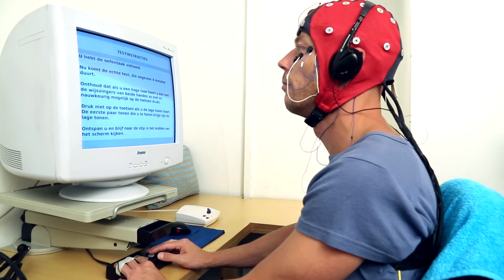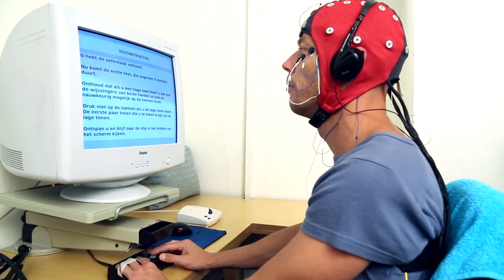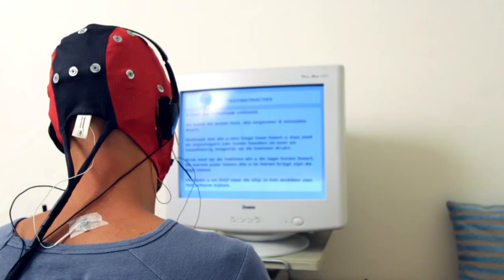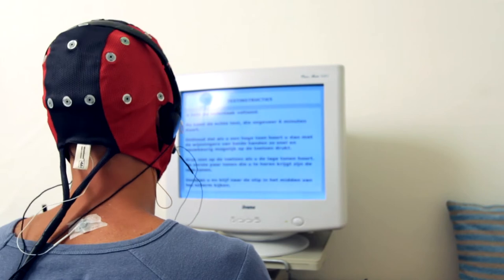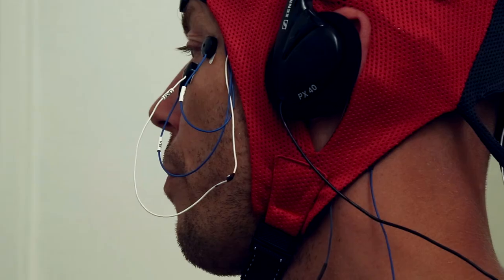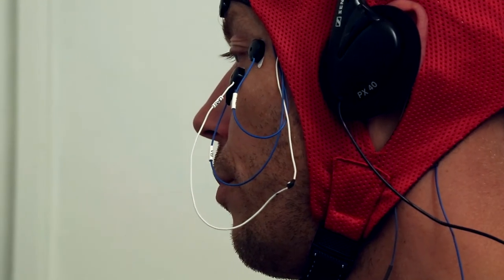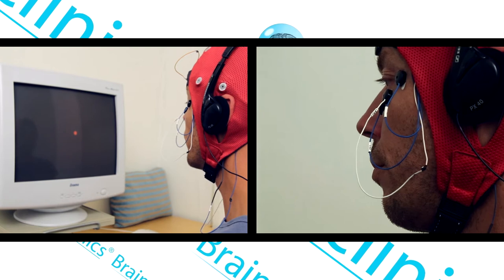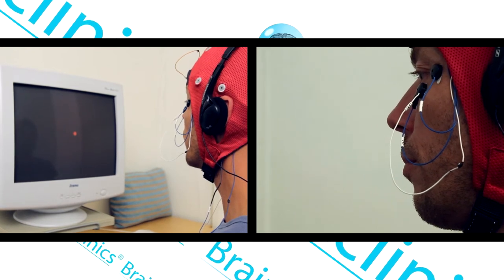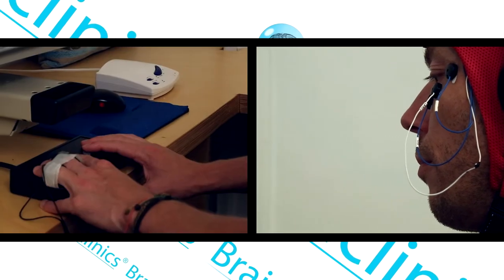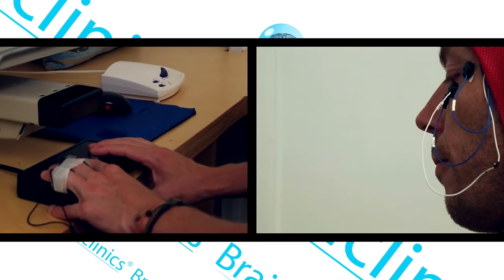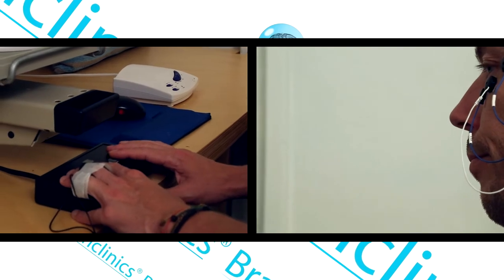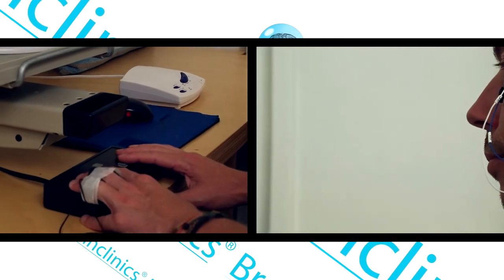When everything is properly connected, the QEEG assessment begins. For different tests, the client receives instructions via the computer screen and headphones. The whole QEEG assessment takes about an hour, and the client is asked to complete several tests using a button box.